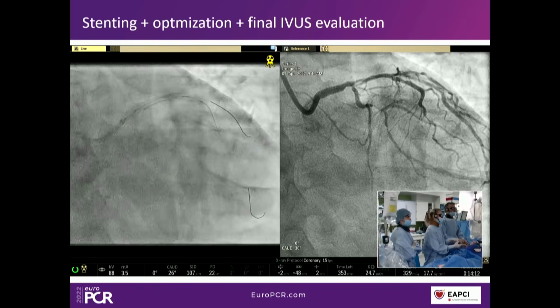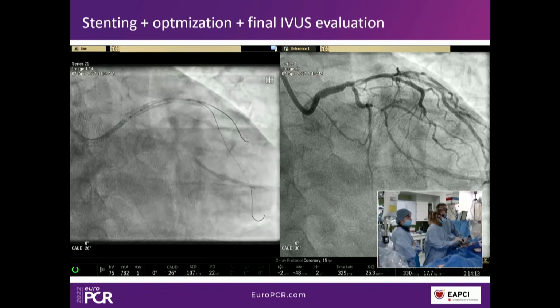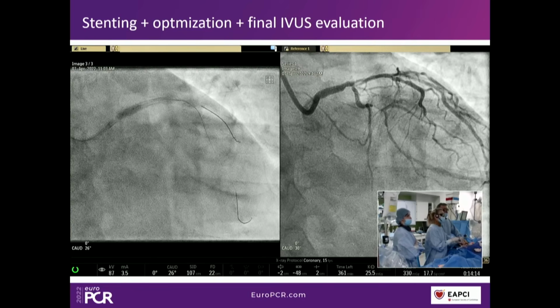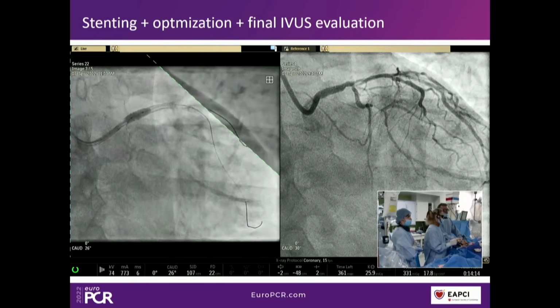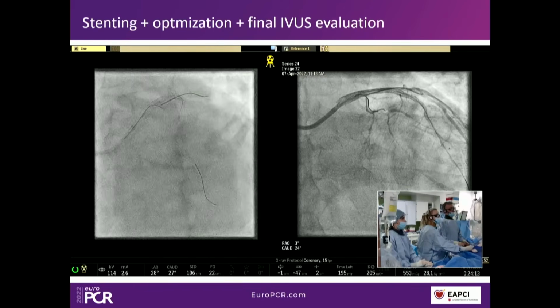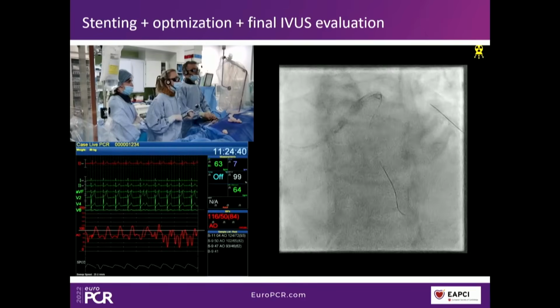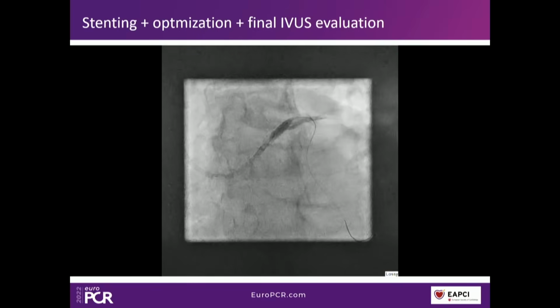The 4.0 or 5.0 pop balloon in the left main. Yeah. Inflating. Bring it back a little bit. Well, it seems to cover the stent, doesn't it? It really expands a bit. I mean, we know the stent's well expanded, it's just to get a better lumen. Bit of volume, yeah. Okay, great. Okay, down from 12. Okay, inflating.